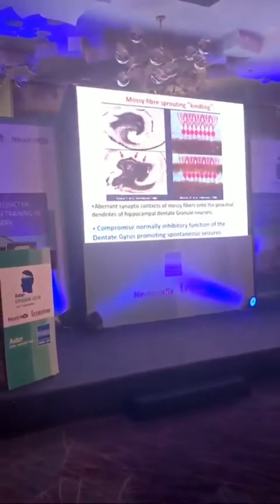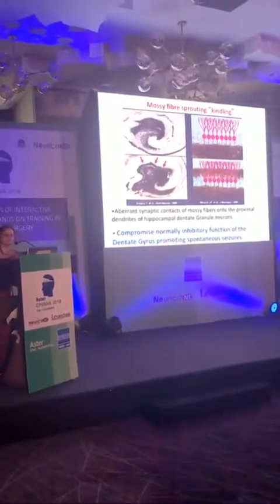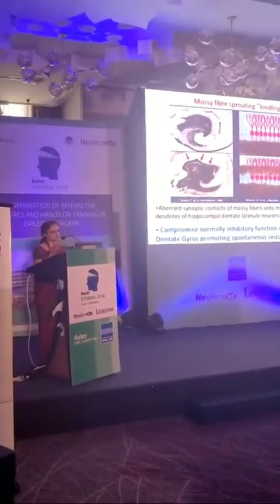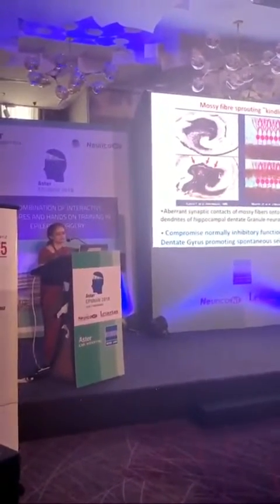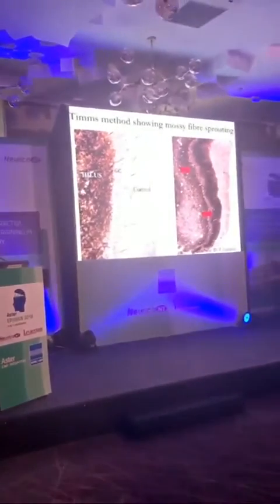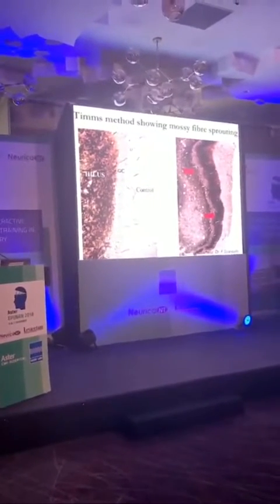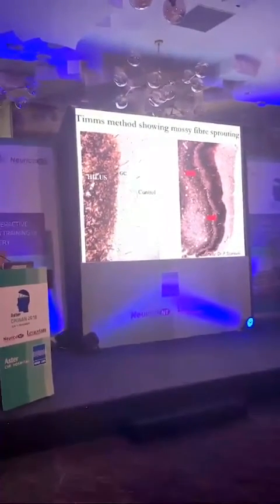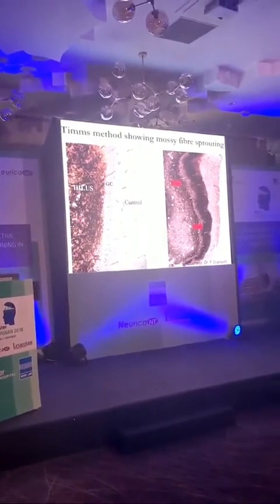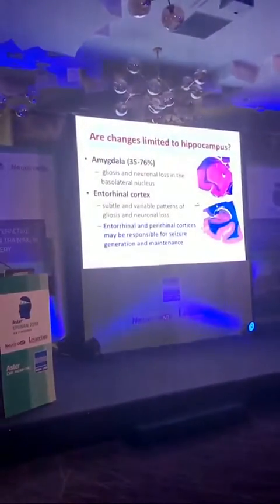Now, the mossy fiber kindling phenomenon is something that reorganizes the entire hippocampus, because you have lost neurons, so there have to be new connections formed, and this reorganization is another reason why you may be seeing seizure activity. There is a stain by which we can look at this. Normally, this is the hilum of the dentate gyrus, where you'll see most of the synaptic activity. When you look at hippocampal sclerosis, you'll find extra synapses above the dentate gyrus, and that's called mossy fiber sprouting.